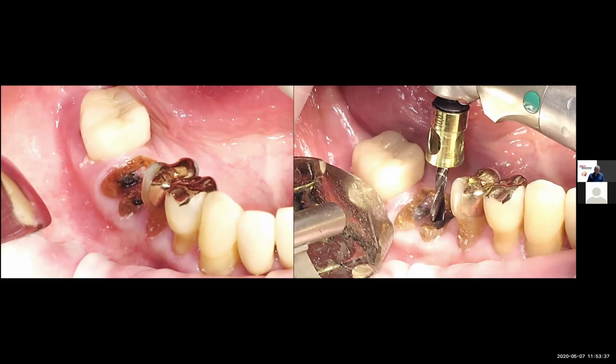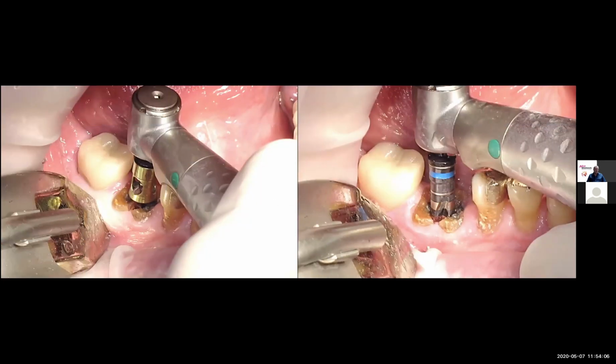If I have a tooth that is broken, decayed, especially in the molar area, I have problems placing that implant where the bifurcation would be, because that bone is very thin. So my preference is to either cut the crown off, break it, but do the sequential drilling starting at the bifurcation, leaving the mesial and distal roots in place. Prepare the implant site.